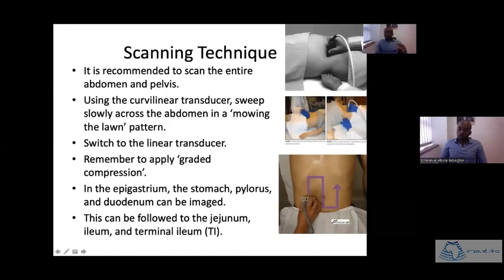So once you identify that, the cecum will just be next to it, to the patient's right. And just around there, in the ileocecal region, you find the appendix. So it's always important. That's why you check everywhere, then come around and take your time on the right side to be able to visualize those important bowel landmarks, which are the terminal ileum, the cecum, and the appendix.